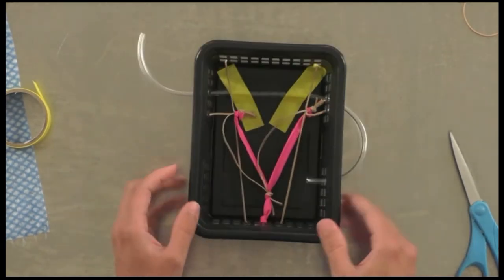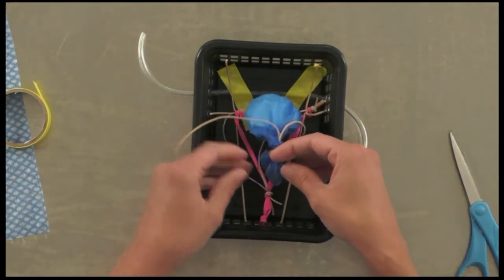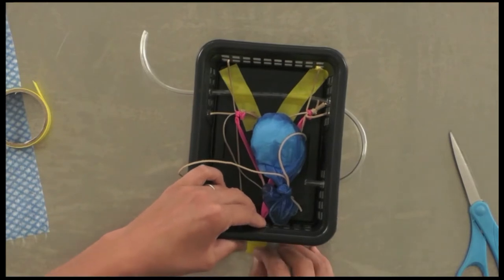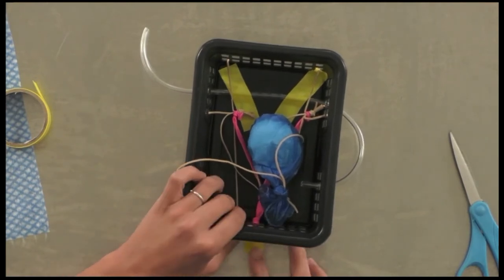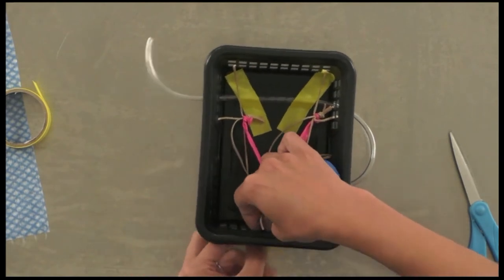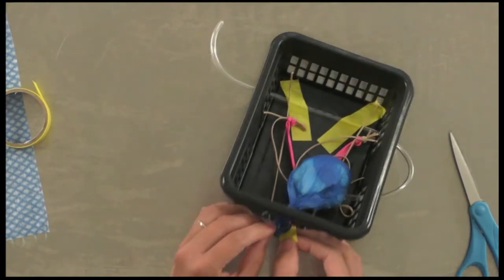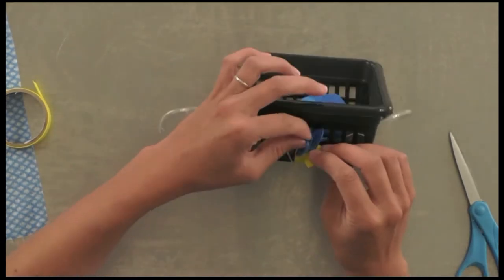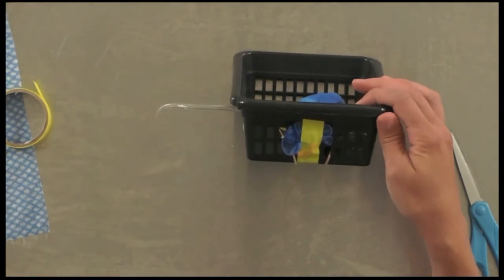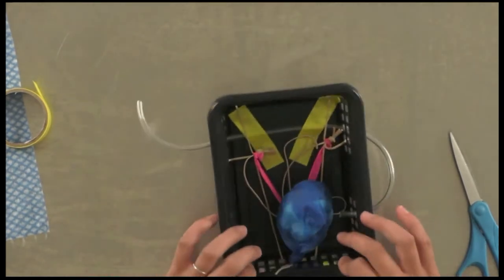Now insert the bladder — remember the ureters are dorsal, so when you insert your bladder over the uterus you may need to go slightly to the side. Make sure to turn them so that the ureters are dorsal, then secure with tape. Reuse some of the uterus tape and add an extra piece to make sure it's nice and solid.